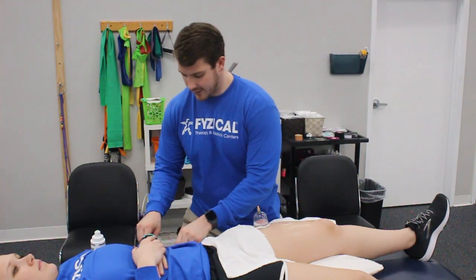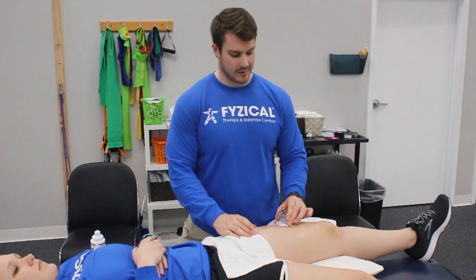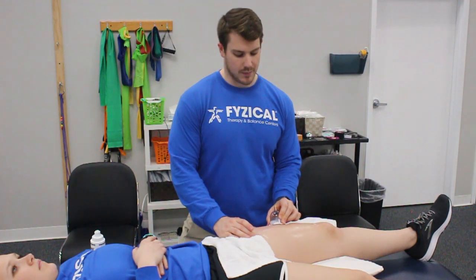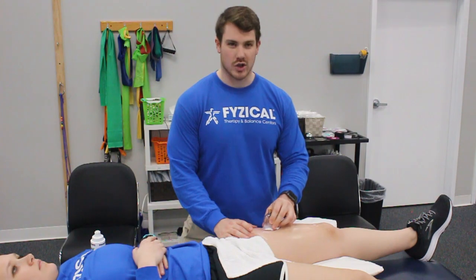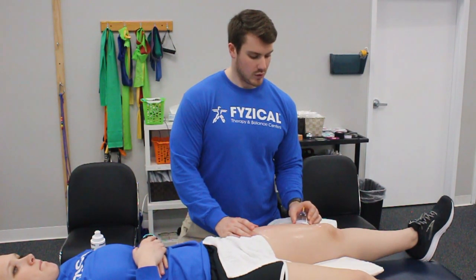When she's done with that, I can take a few off and just do more of a massage to the area — moving in a U shape, coming up and around, loosening up all this tissue. If we find a trigger point, sometimes we'll leave the cup on it, which can help with the pain and the size of the muscle knot.